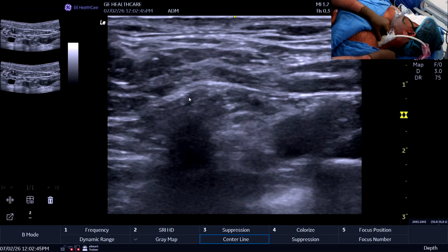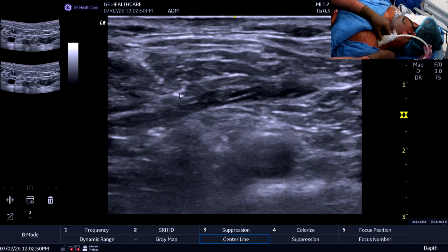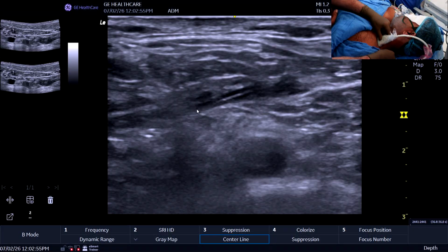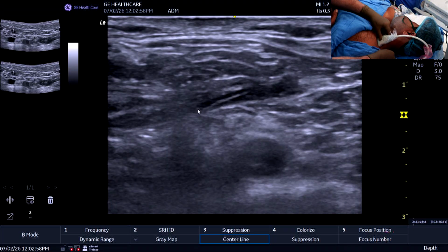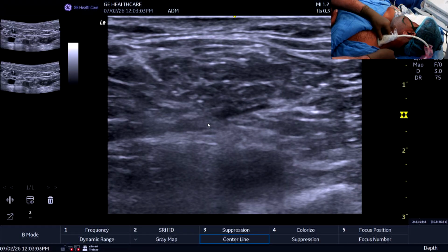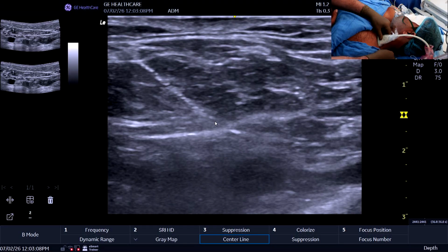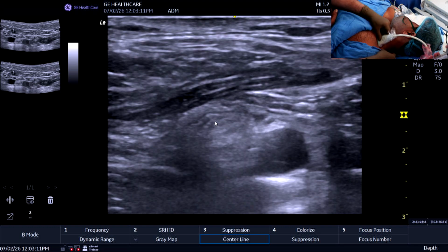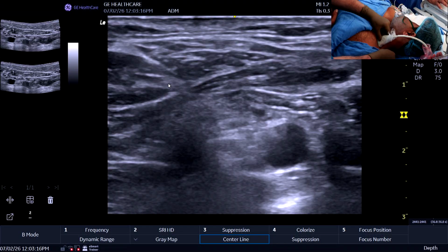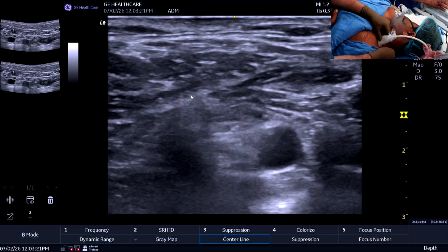So that is the needle tip, which I can see now it's close to the omohyoid. It will pierce the omohyoid muscle, and it has to go beyond the omohyoid. So it's going more caudal, just below the omohyoid. Yeah, can you inject, please? So we'll try and see whether we are below the. Wait, one minute, one minute. So I think more feasible would be this. So I place the needle tip a bit more cephalad, just below the omohyoid.